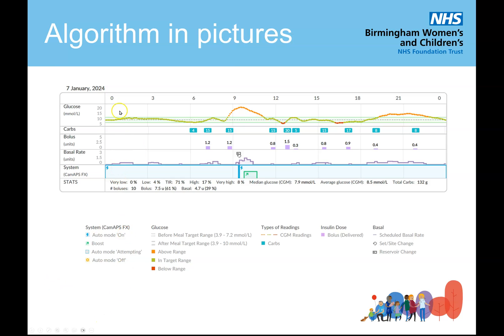Here in real time, across the display you can see glucose values — the green area is between 4 and 10, so green dots every five minutes within that band are in target. If the dots go above 10 they turn orange, and below 4 they go red. You can see the carbs entered across the display — with the CAM system there's a feature called ADMIL, so if someone puts in 4 grams to stop a hypo without wanting insulin, you'll see the carbs entered but no bolus delivered. Generally you'll see carbs with the corresponding insulin required and the bolus insulin delivered below.